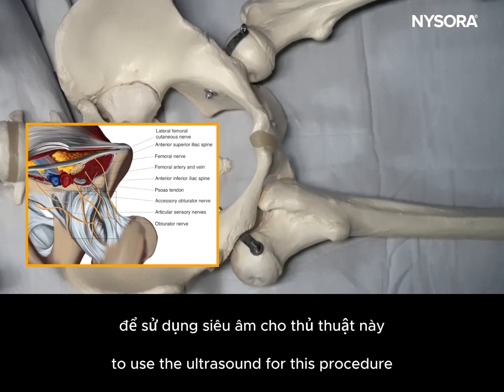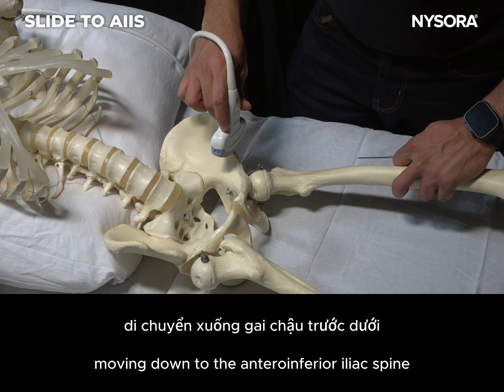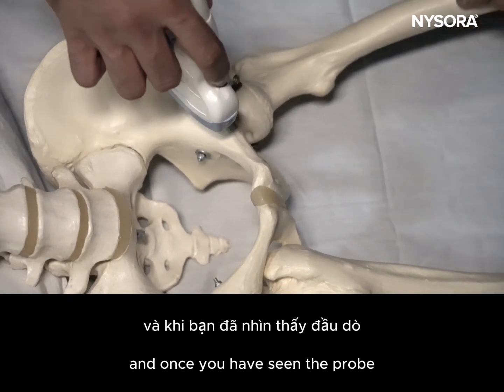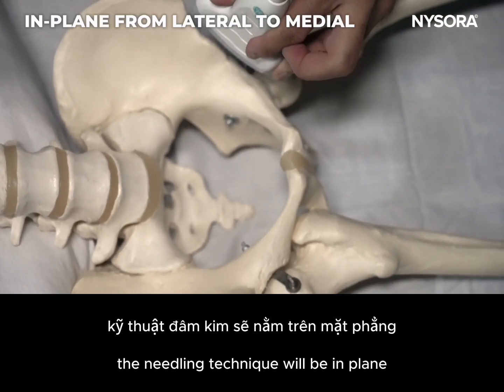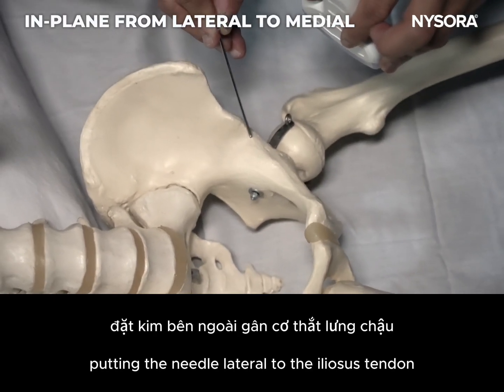To use the ultrasound for this procedure, your scanning technique would be starting with the anterior superior iliac spine, moving down to the anterior inferior iliac spine, turning the probe along the inguinal crease. Once you have seen that, the needling technique will be in plane, going from lateral to medial, putting the needle lateral to the iliopsoas tendon.